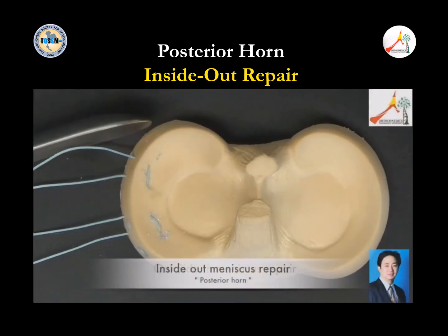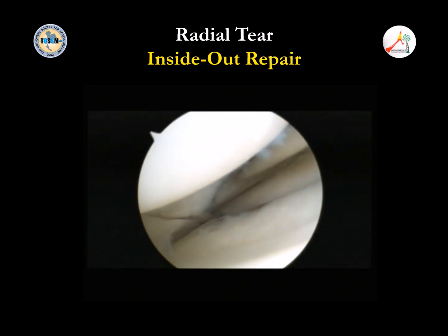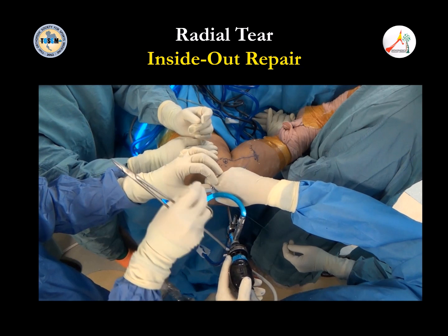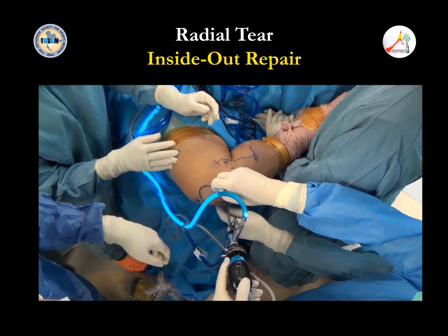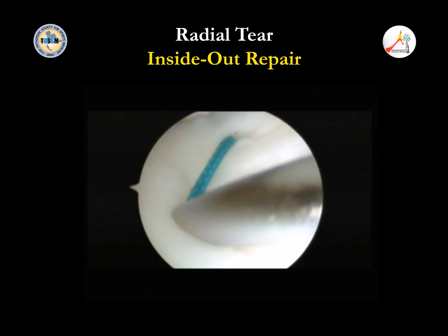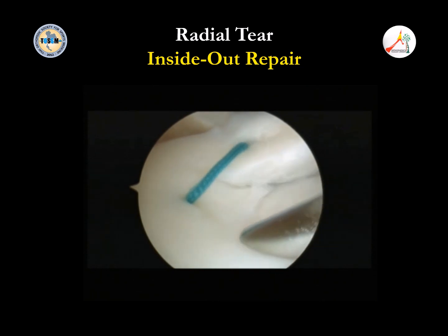This is a posterior horn of the meniscus. I show you one patient. This is the oblique tear. So in the past we did a lot of cutting of the oblique tear, but actually with an oblique tear or radial tear, if it's too big, like Prof. said, you get like a root tear because you lose the hoop tension. Or if you cut the meniscus, the patient will have arthritic change very fast. So we try our best.